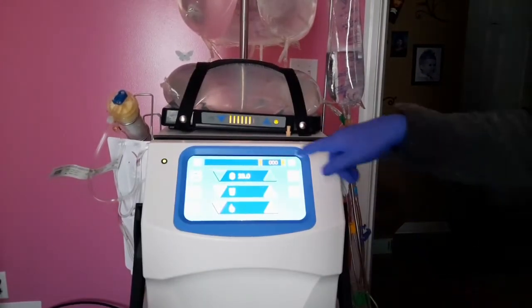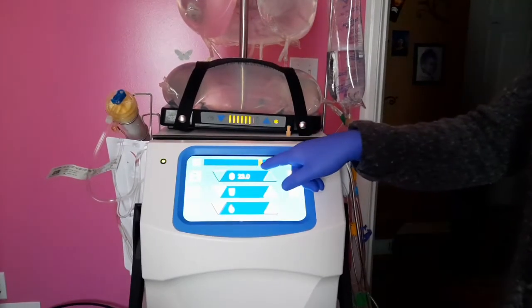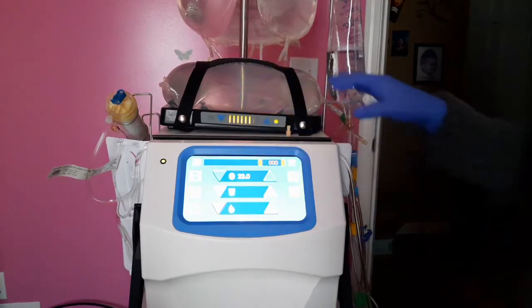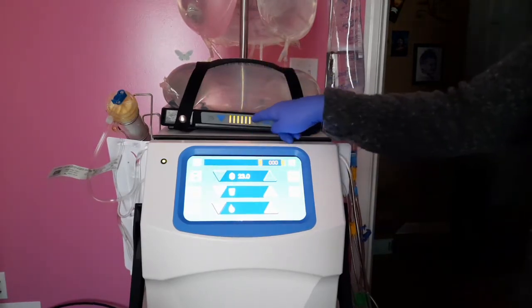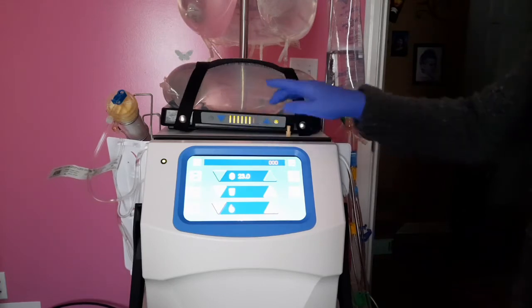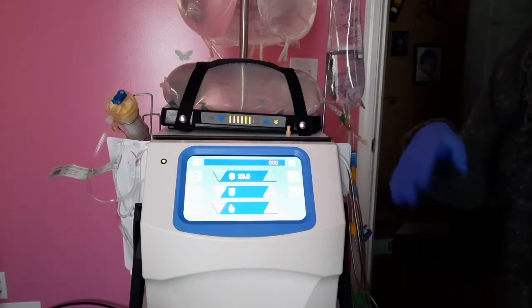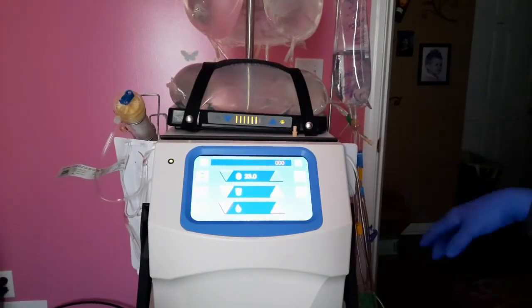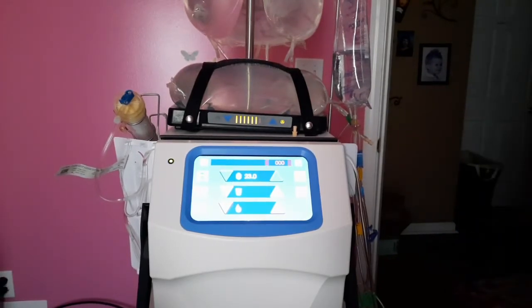Okay, so it's giving me the triple zeros and 23 again. So that means it's system checking again from that pressure. I went ahead and hit the arrow up to 6 bars on my warmer. That's how hot I like it. You do 4, 2, whatever. It warms up. It keeps the blood warm when you get it back so you don't freeze to death.